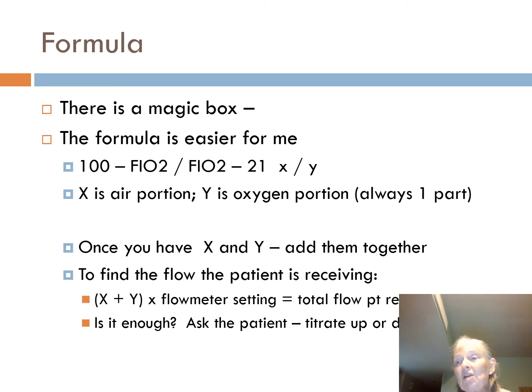And do you know if the patient's comfortable? Are they getting enough flow, not getting enough flow? Best thing to do, always ask them. Do you feel comfortable? Do you feel like you're getting enough air? If not, titrate up. If it's too much, titrate down.